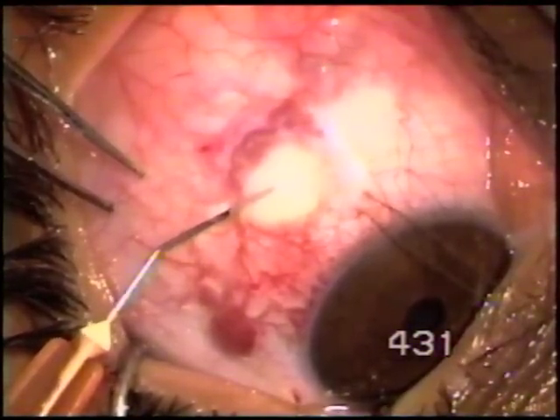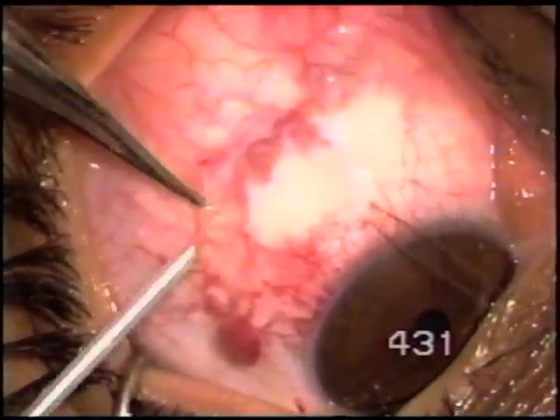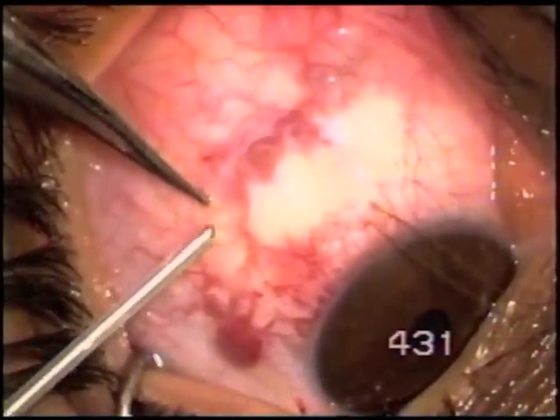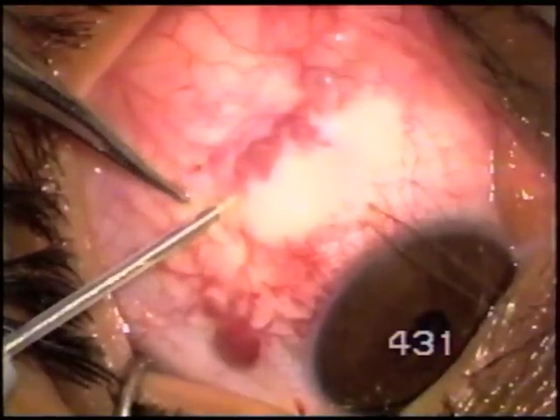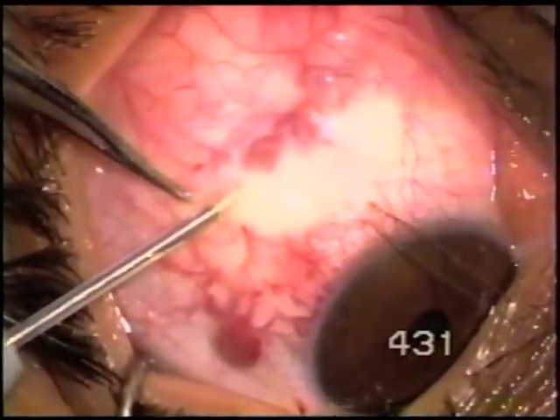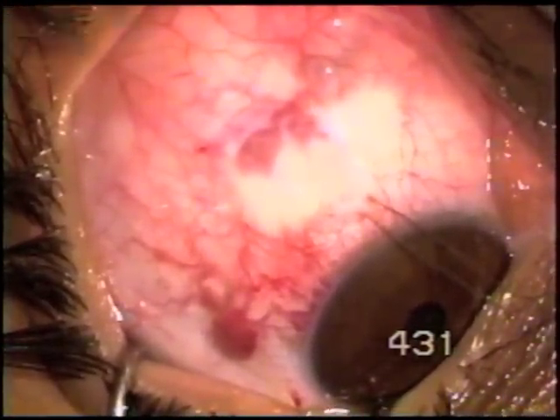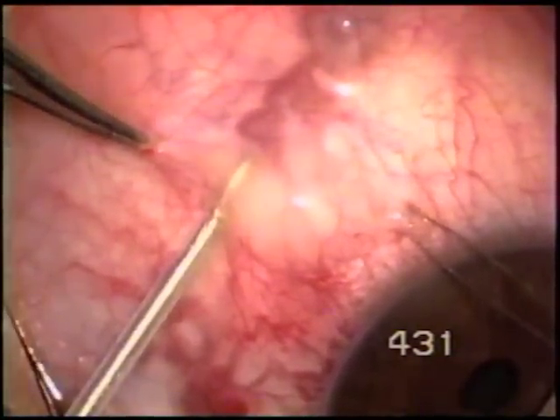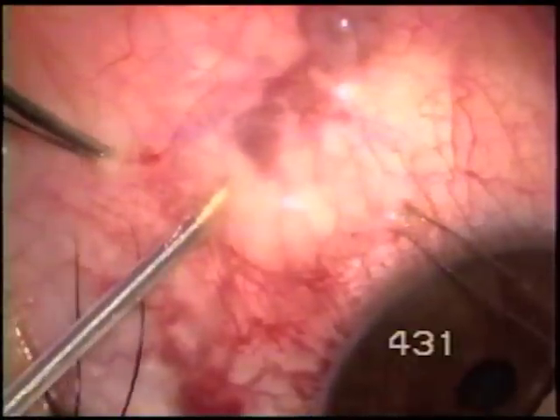The subconjunctival tissues are being ballooned with Healon, and here is the 600 micron fugo blade tip. With it, the feeding vessels of the paralimbal lesions are being closed. The machine is set at the lowest power setting.